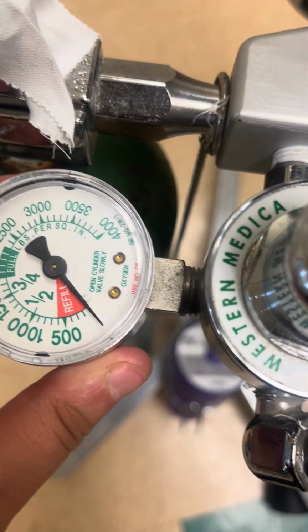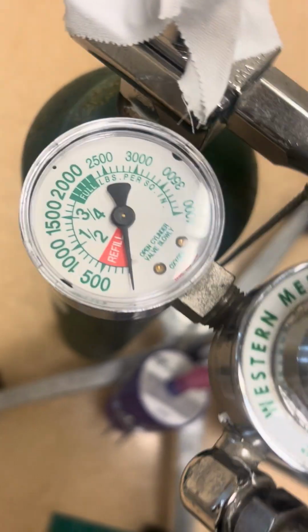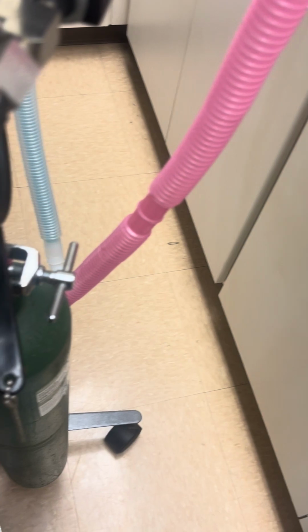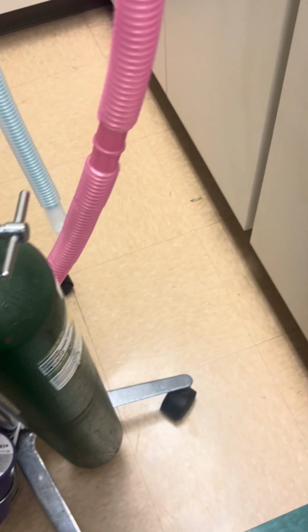Right, then our next piece that we have here is the pressure gauge. This just shows us how much O2 is left in the tank. It's kind of similar to a fuel gauge in your car, it tells you how many miles till empty. All right, and then the fifth step is the oxygen tubing, which is this green part right here. This carries oxygen from the oxygen cylinder to the flow meter.